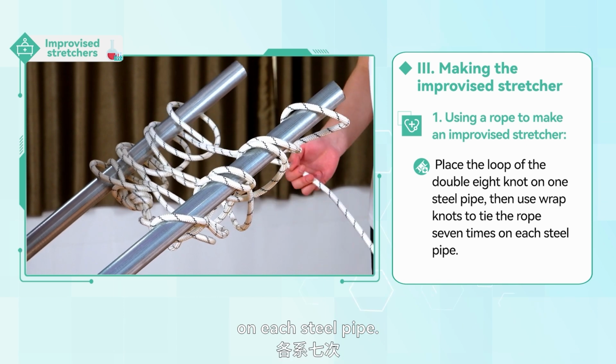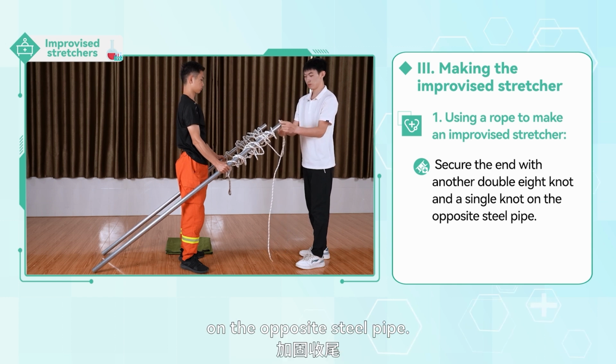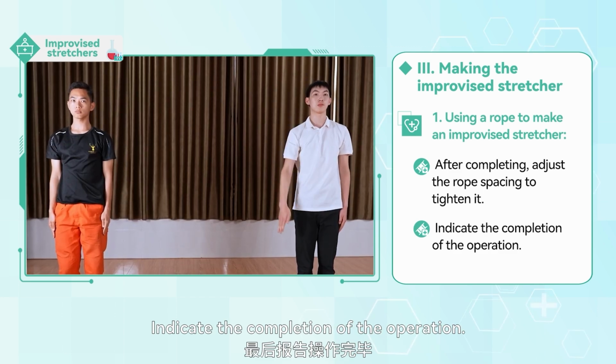times on each steel pipe. Secure the end with another double-8 knot and a single knot on the opposite steel pipe. After completing, adjust the rope spacing to tighten it. Indicate the completion of the operation.